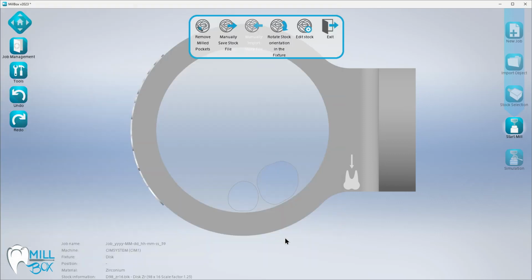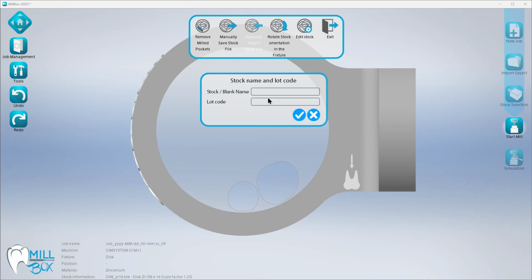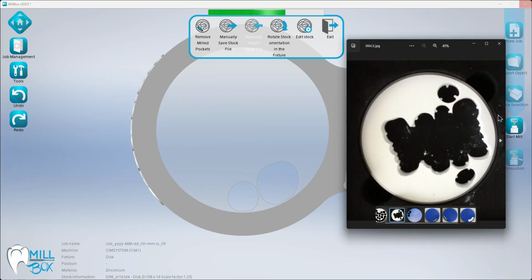There's my disk file. I'm going to open that up, set some parameters for the thickness of this disk, the shrinkage factor, and then if I want to give it a name, lot code, and then now MillBox is going to analyze those curves. It's going to project curves based off of the image, and then ultimately give us a representation of that stock file directly inside the CAM software, which is pretty cool.